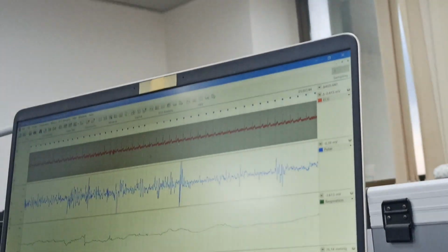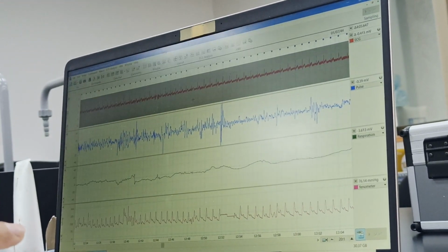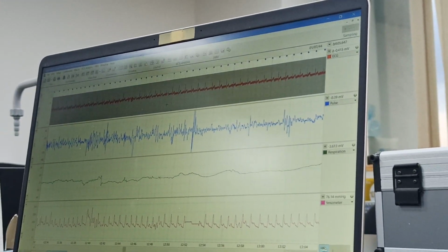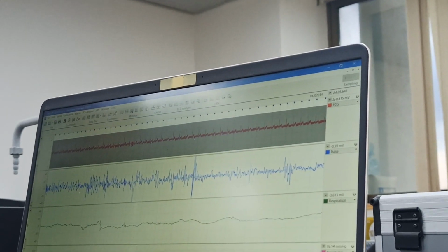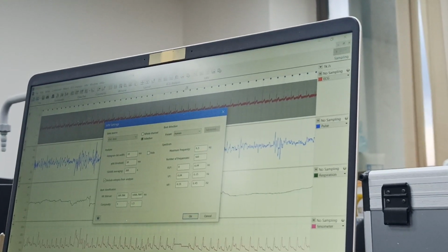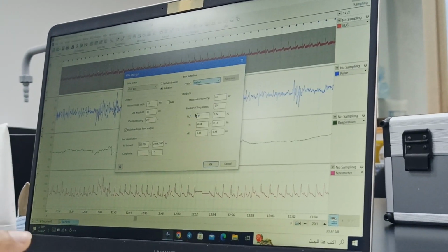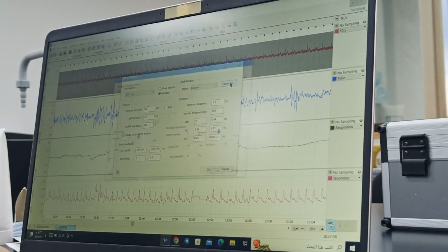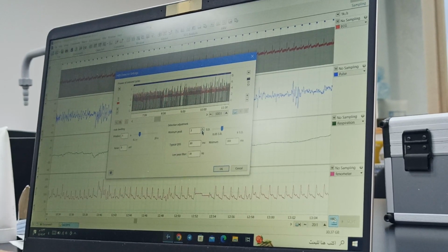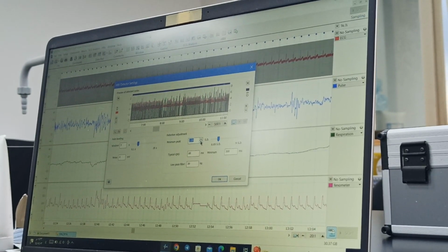The program has this inbuilt capacity that it calculates the average height of the R waves, and within 1 or 2 standard deviations, if the variation is there, it will include those R waves. But if it goes beyond that, it misses. Now, in settings, we can have a little bit of change. It is a preset thing. Now we will do a custom thing, go to advanced, and decrease the standard deviation to include that R wave. Maybe we do it to 2, because our R waves are reasonably big.